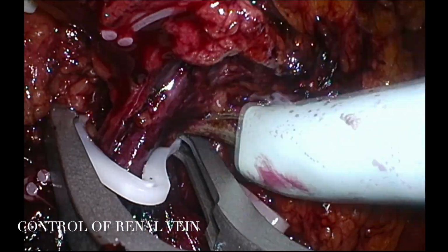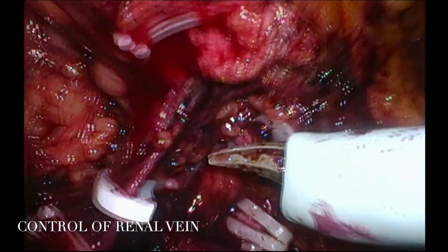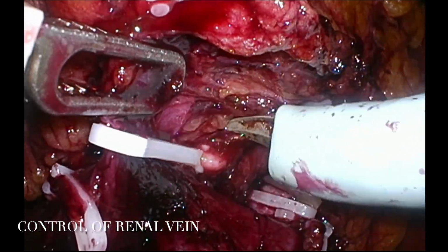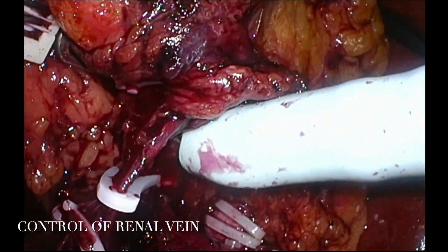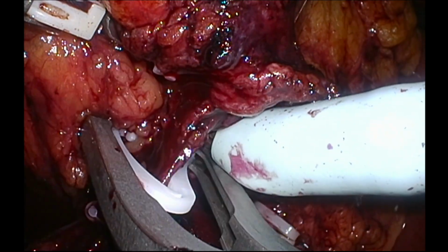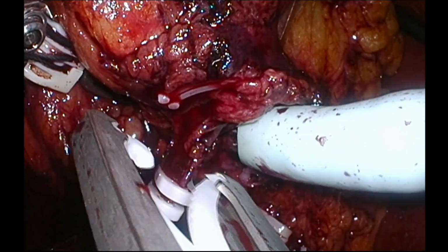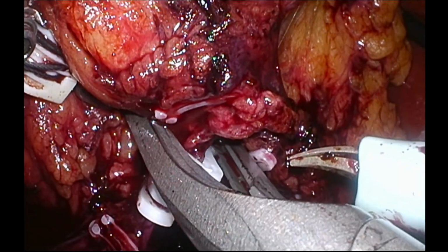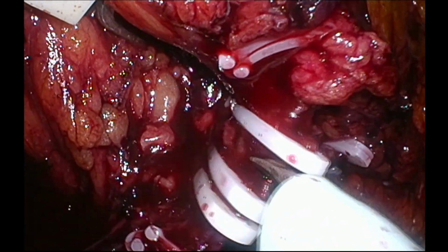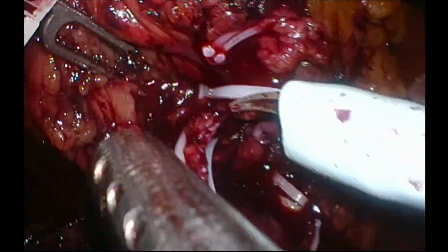These are extra large hemolock clips. 2 clips are applied towards the inferior vena cava side and one clip is applied distally. Between proximal and distal clips, renal vein is cut.